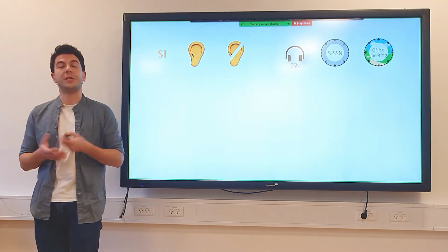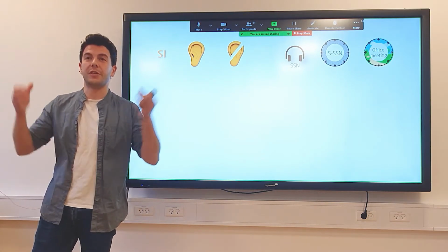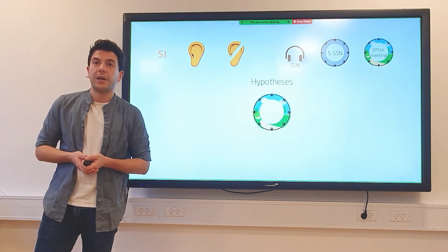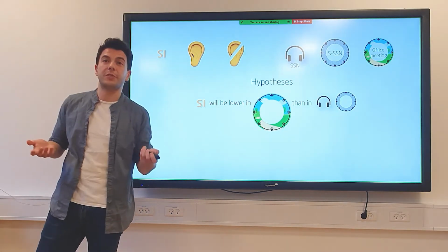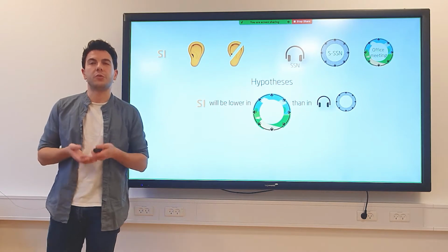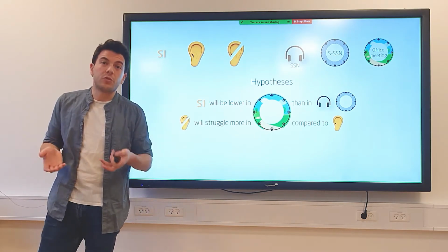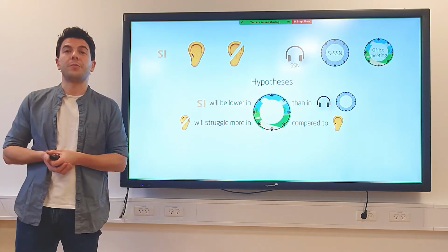We also had an intermediary condition using spatialized speech-shaped noise presented over 4 loudspeakers in the horizontal ring of the array.